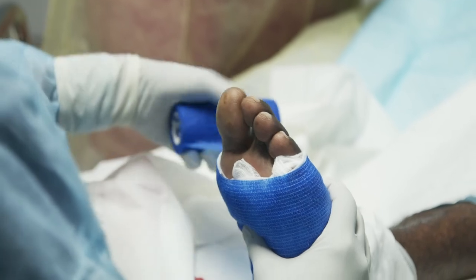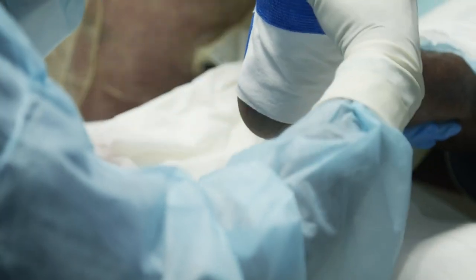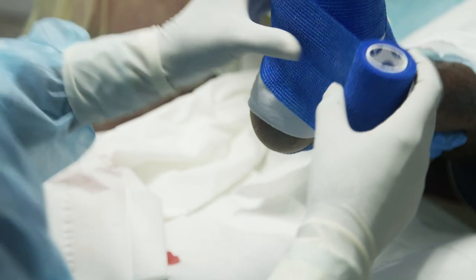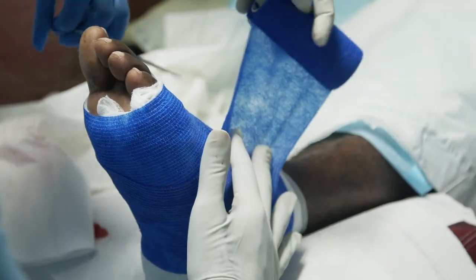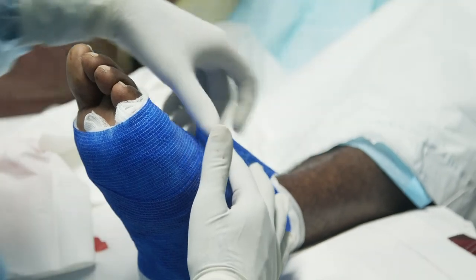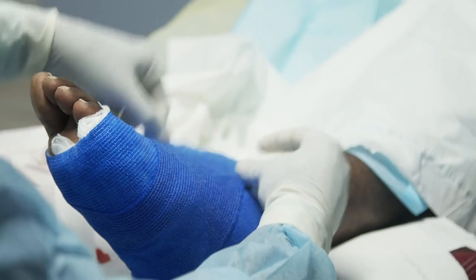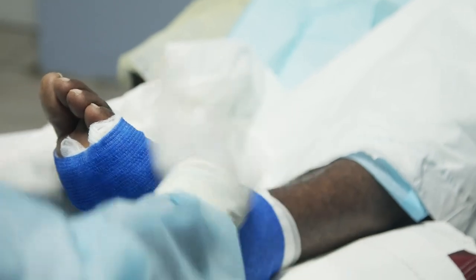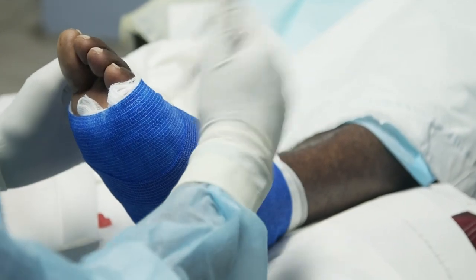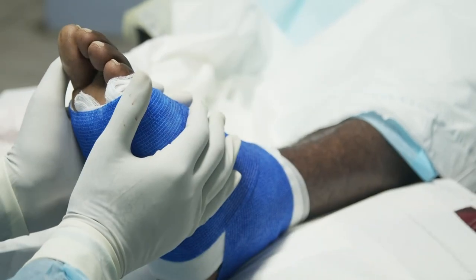Once again, nice and loose. Raise your leg up for me. Here you go. Around, still loose on the top there. Make sure it's not too tight. Maybe a little snug around here. Put your foot down again. And cut right there. I don't use any tape. We use this soft roll. So if he feels it tight in the night or feels his foot swells up, you can just tell him to grab it and open it. The vessel that supplies there is on top. The posterior tibial vessel is not occluded at all. We leave that and make sure there's nothing going on in the back here. Dorsal is nice and loose, and if he says, oh, my foot's swelling, oh, I feel something, you take that, open it, and it sticks to itself.